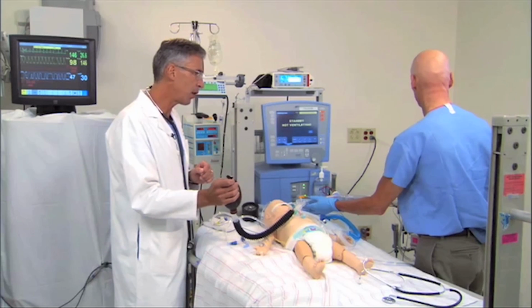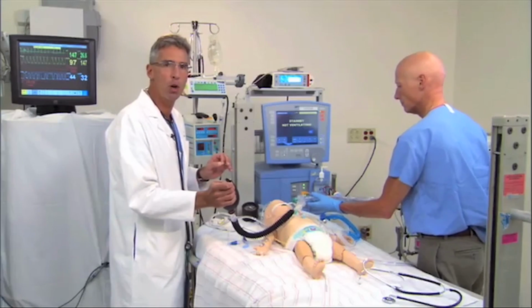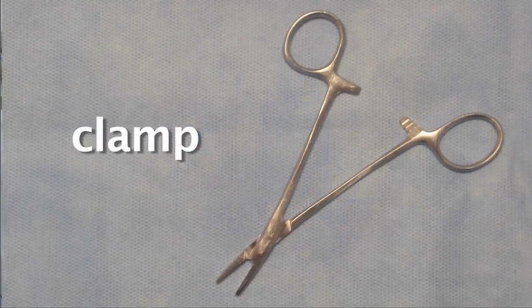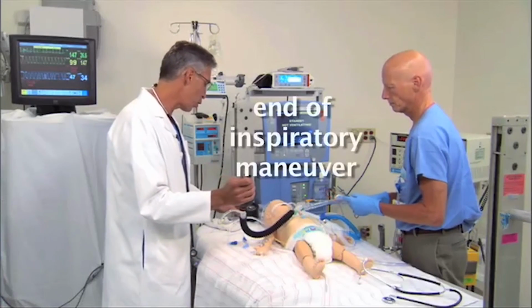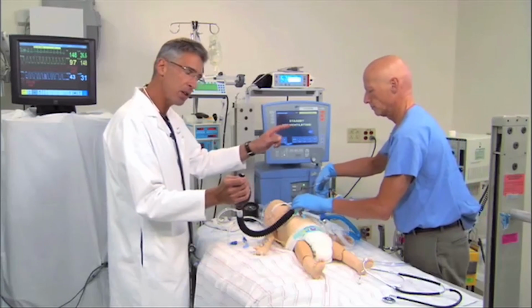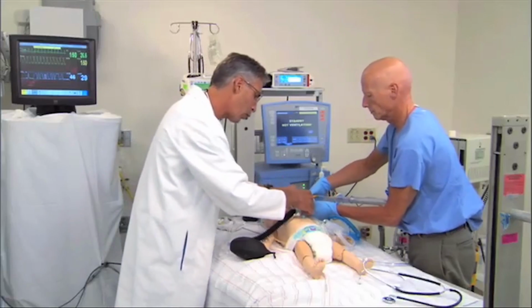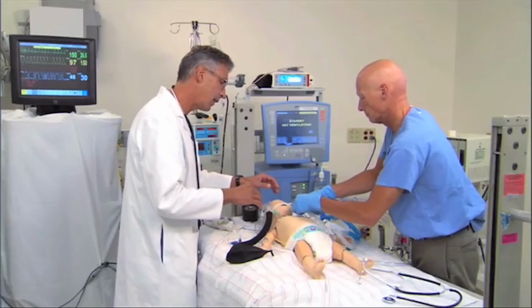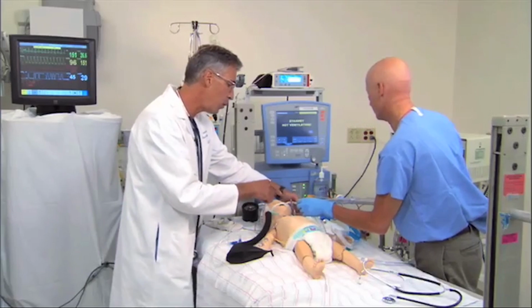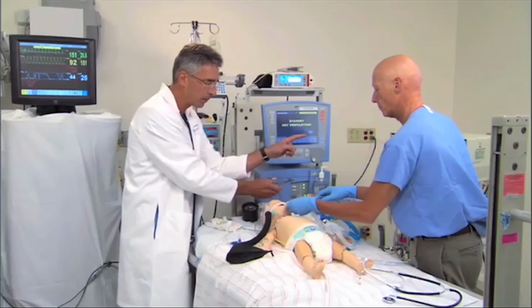Now, Barry's going to demonstrate something very important, and that is the way that we try to maintain lung volume recruitment when we transition. We typically use a clamp, a non-cutting clamp, which we apply to the endotracheal tube, and at the end of an inspiratory maneuver, Barry's going to clamp the endotracheal tube. He started the piston on the oscillator. Go ahead, Barry. And now I will remove the bag, and Barry will apply. Now the clamp is still on. We repressurize the circuit. We all set, Barry? We're good. And now I remove the clamp.